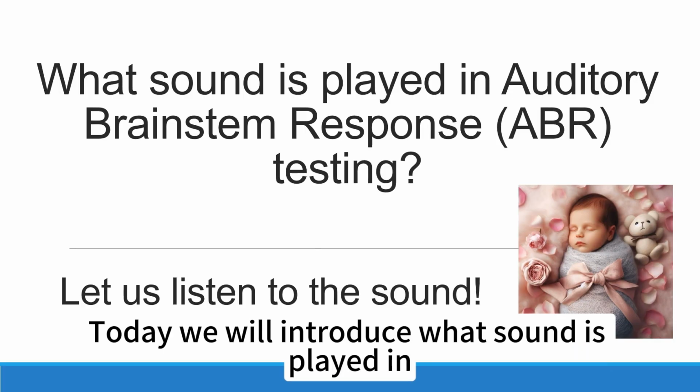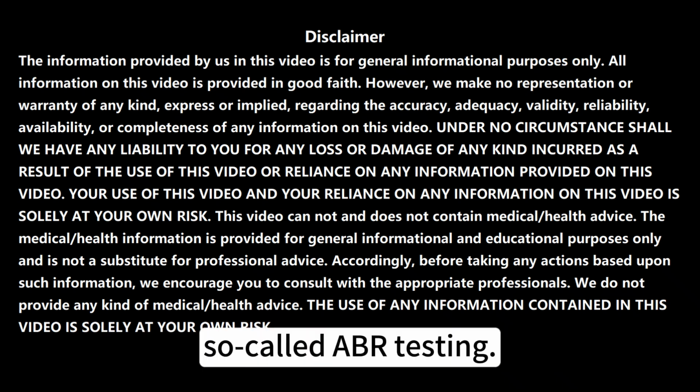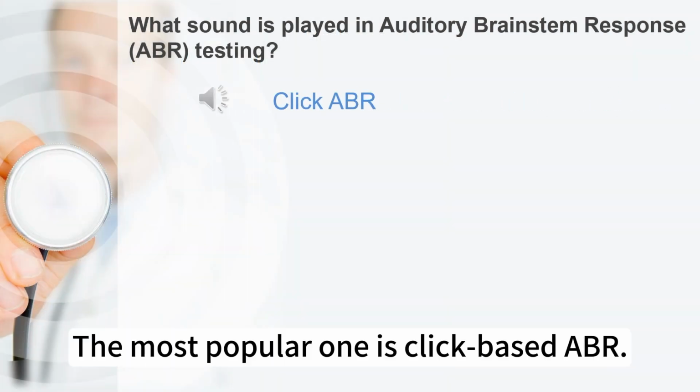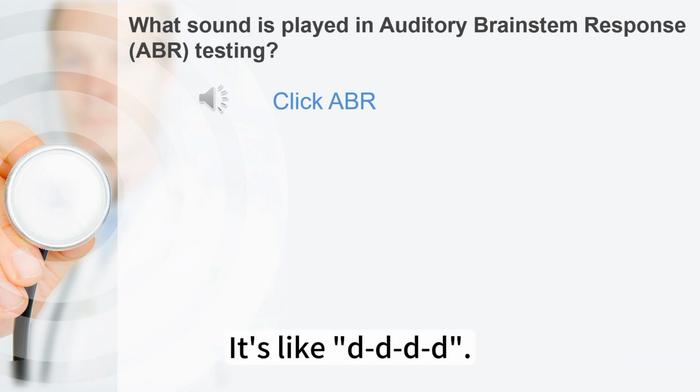Today we will introduce what sound is played in auditory brainstem response testing, so-called ABR testing. Let us listen to the sound. The most popular one is click-based ABR. It's like d d d d d d d d.